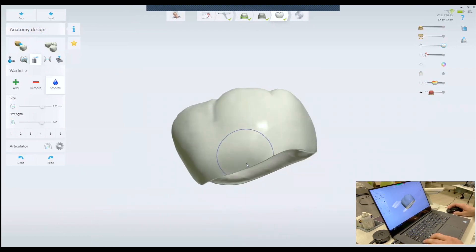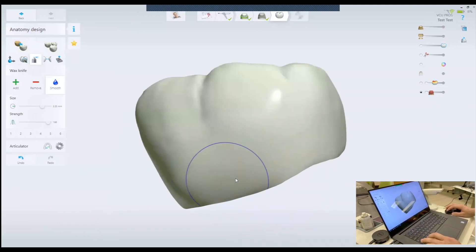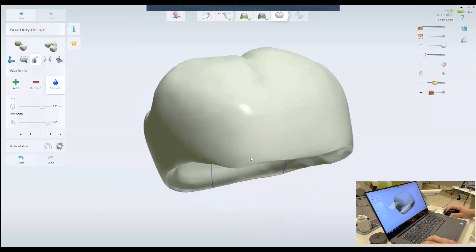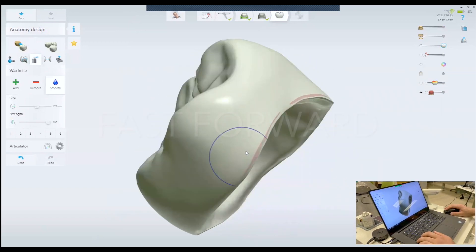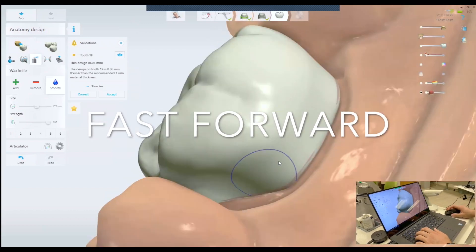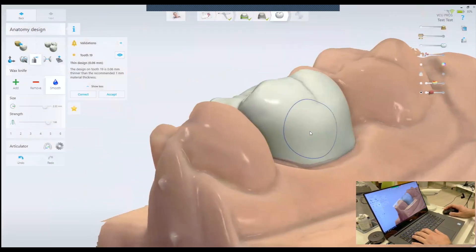So what I'm going to do next is smoothen the cervical contour of the crown.